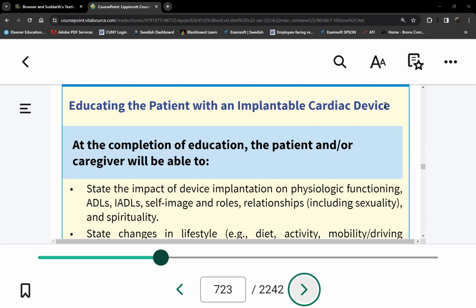Depending also on what type of setting it's on, whether it's demand, fixed, or asynchronous. If it's on fixed, remember the SA node signals will be ignored. It's now the pacemaker that's in charge.